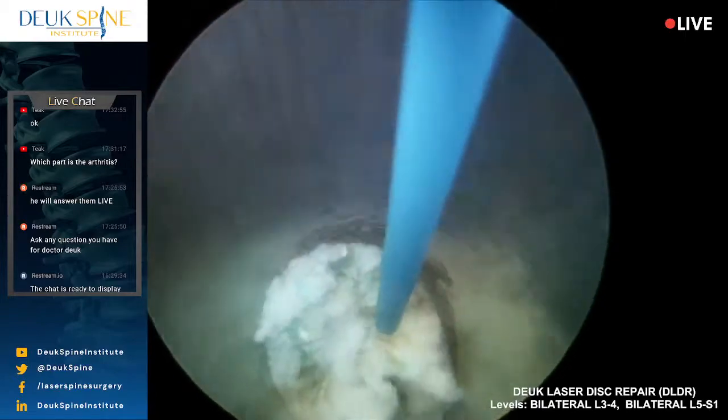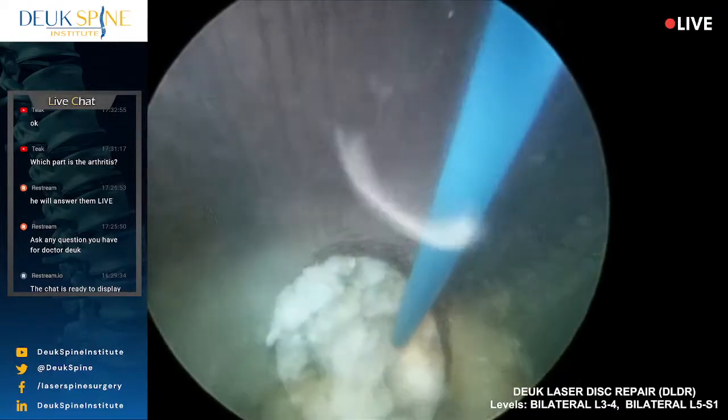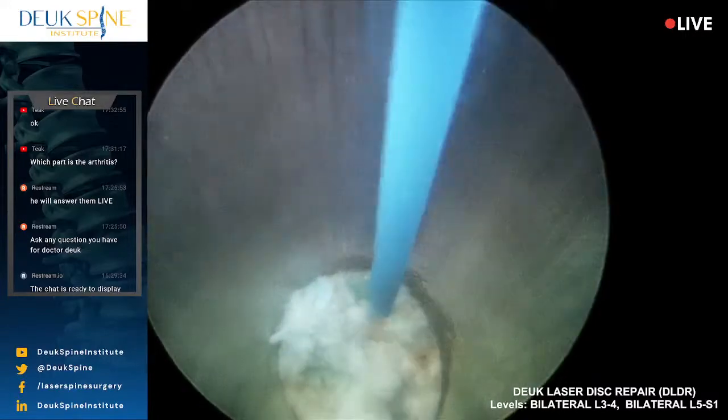I think this patient's going to be so happy when he feels his legs again and his back pain is gone, but my God, it's taken forever to deal with this disc.